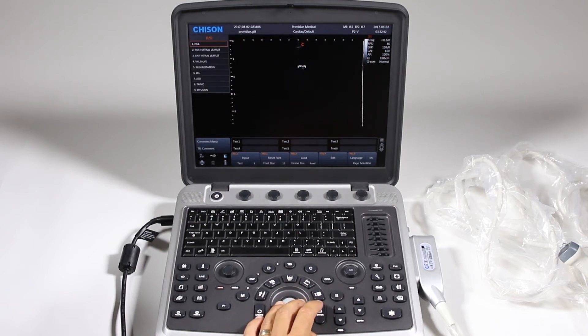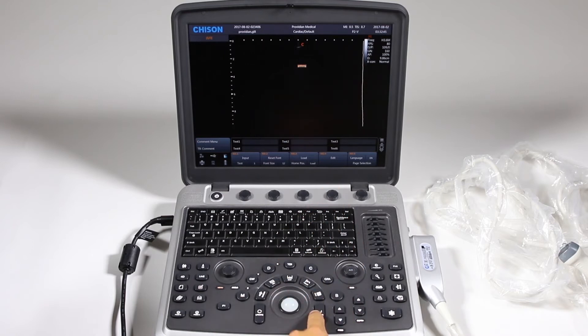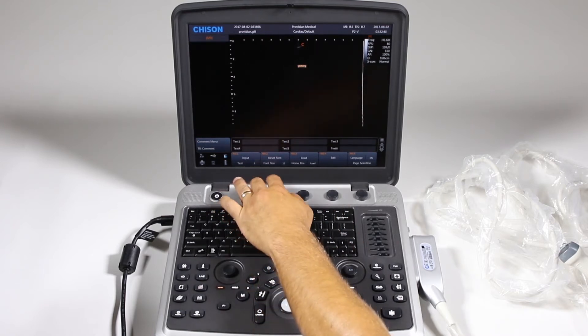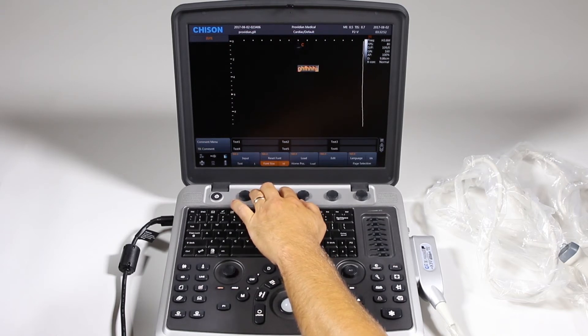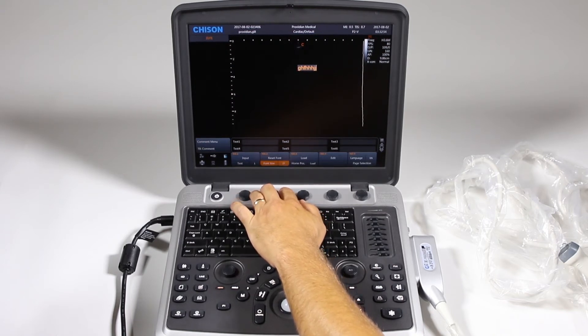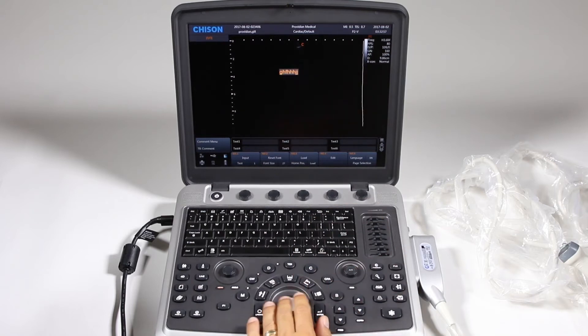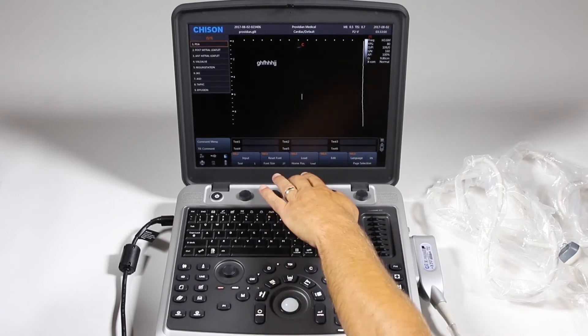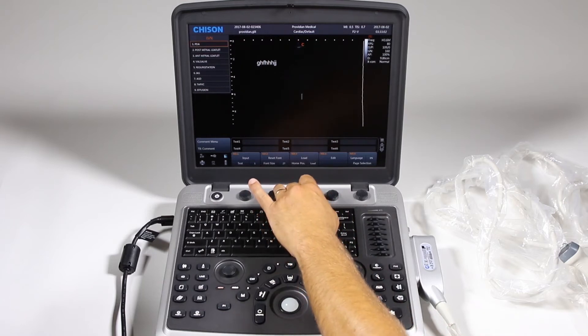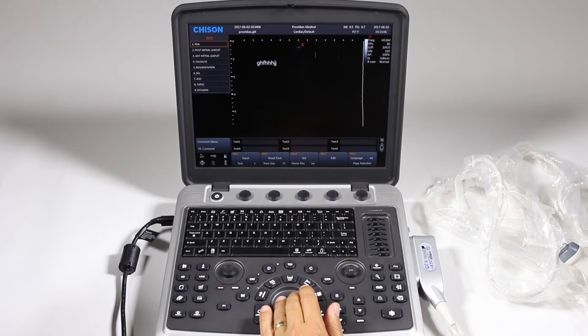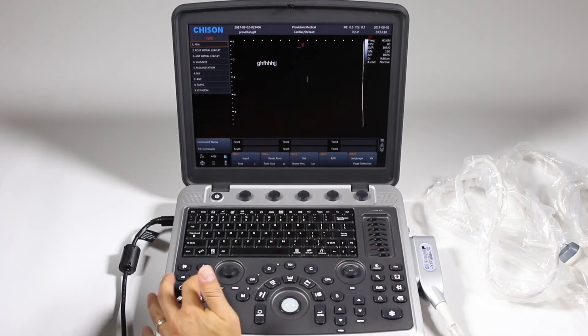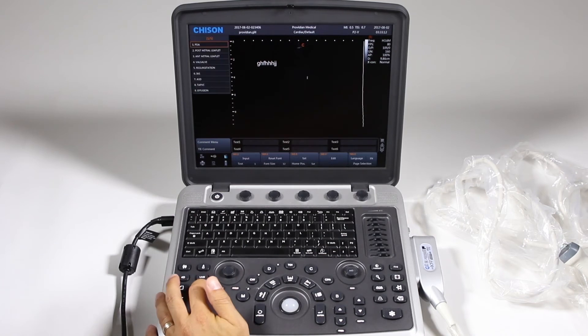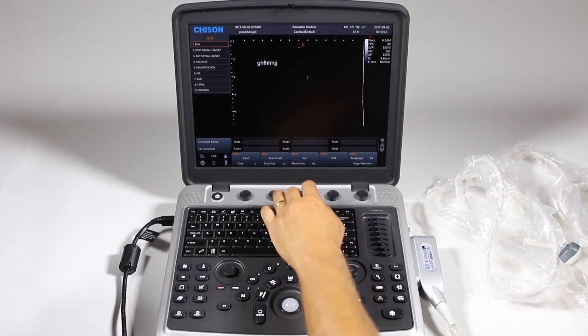Now let's say I wanted that bigger or smaller. I can click on that again using the enter key and I can change the font size here. Also if you want it to appear in the same place, you can set your home position here, move it to the place where you want it, click set. So next time when I hit comment, it will appear in that place every single time.